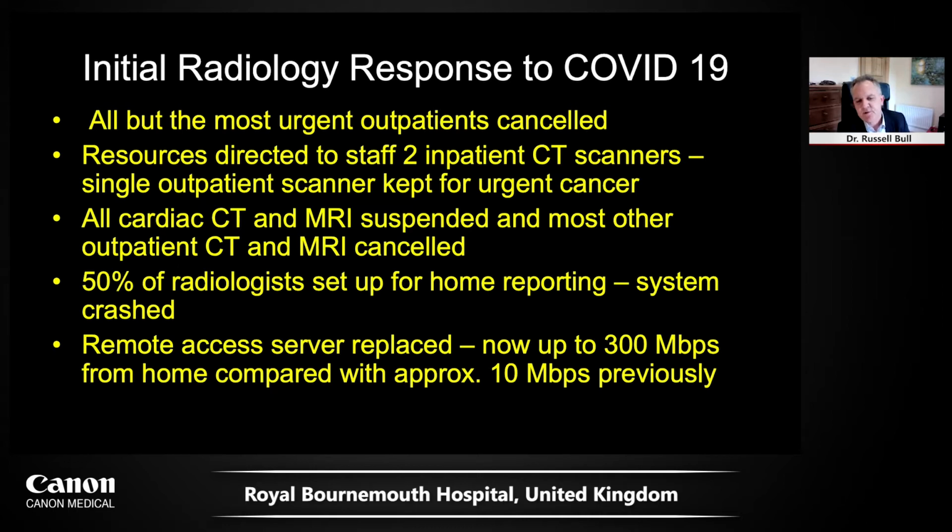And 50% of all the radiologists were sent home to home report, but then the system immediately crashed. The remote access server was fixed, and it was increased to 300 megabits a second from 10 megabits a second, so people could actually report from home. So the hospital went into full emergency mode, essentially.